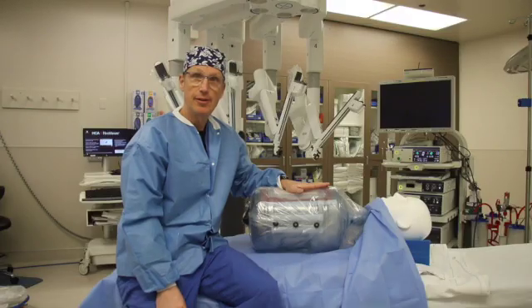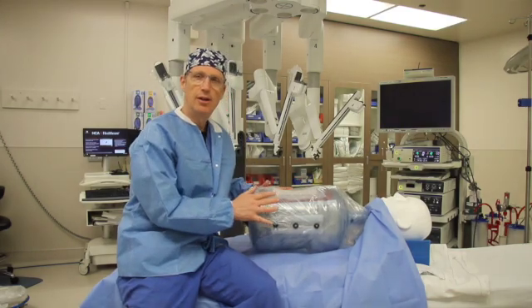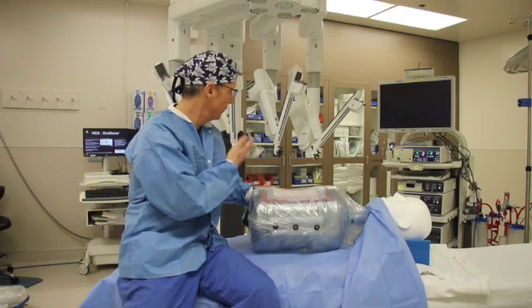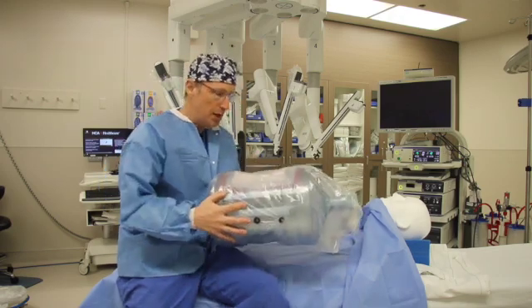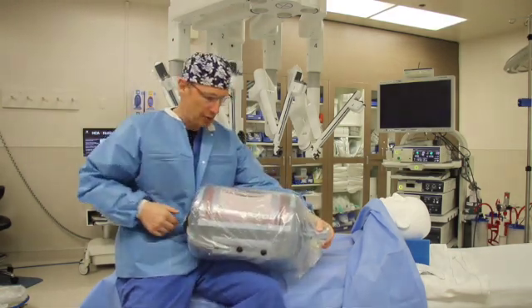What I have here today is a model of the abdominal wall. The idea of this is to show how someone with a ventral hernia, or hernia in front, would be repaired with the Venti robot. The model has an open space on the inside representing where your abdominal cavity is.